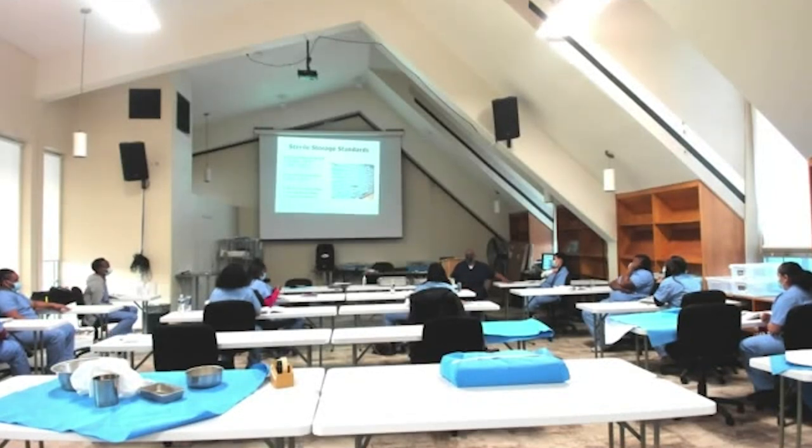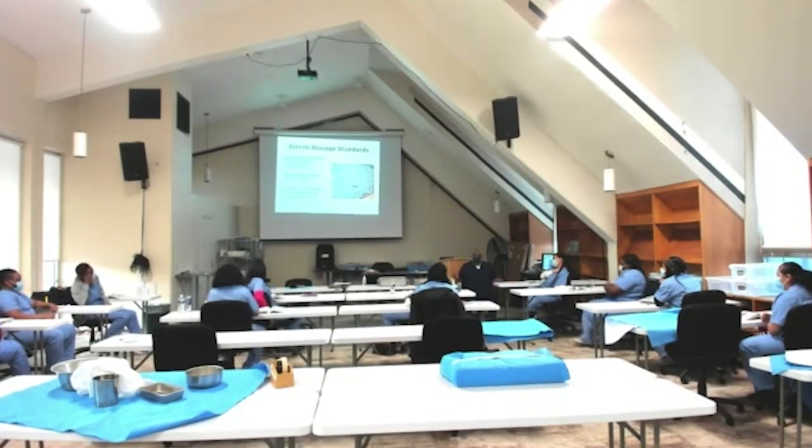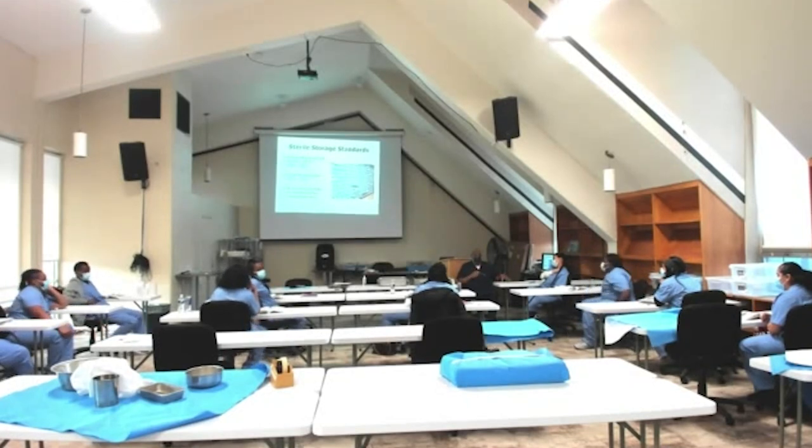So you guys are in steam, and Gabriella is back at prep and pack. She sent the tray, you put it in the sterilizer, and she's saying, why do I have these extra instruments? This looks like something that should have gone in that tray, right? What do you do, Gabriella? Say it again. So what would you do? You did the tray already. You sent it to steam, right? And you've got these extra instruments left that you think go in the tray that's already in the sterilizer. What move would you make?